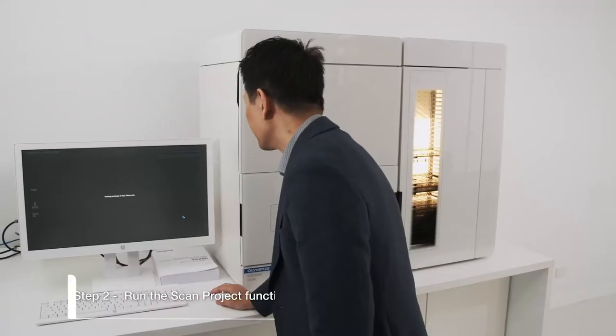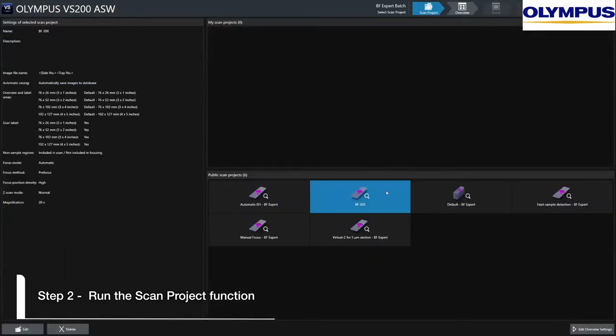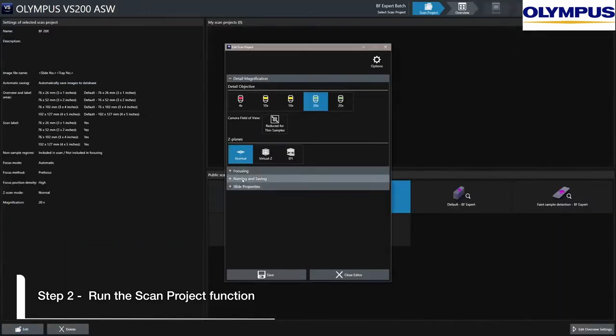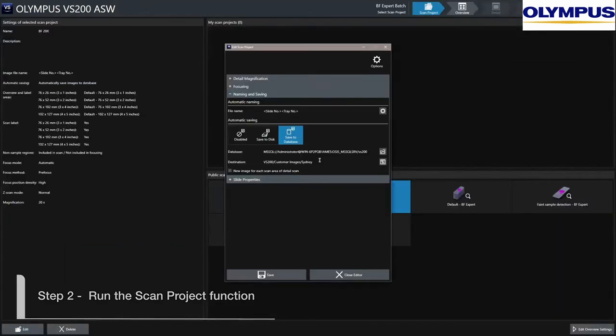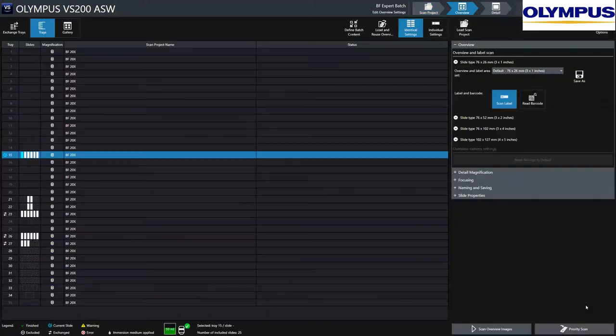Step 2. Run the scan project with the quick or expert batch mode to customise the system settings. Save the image location to server or local.